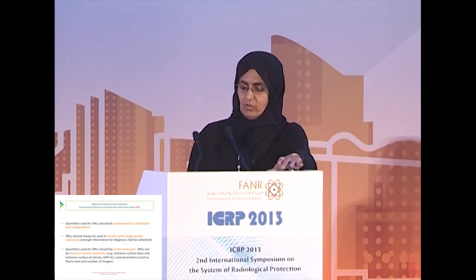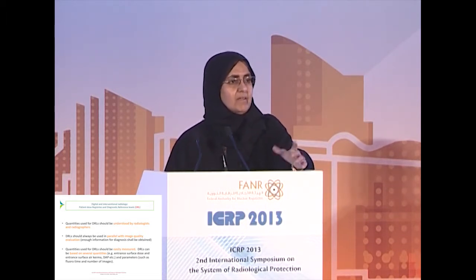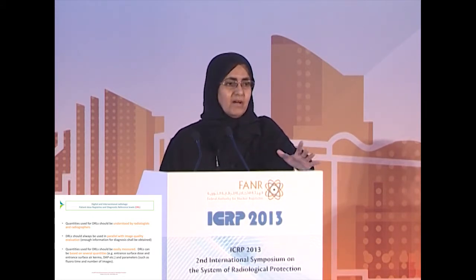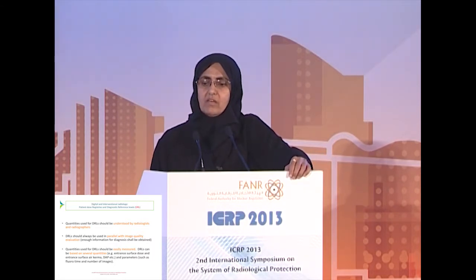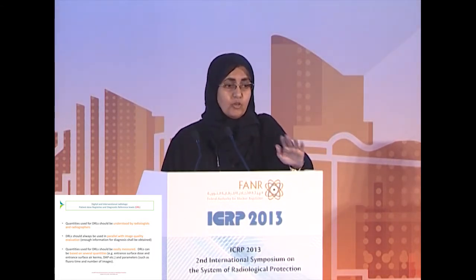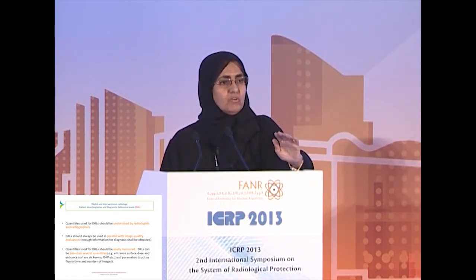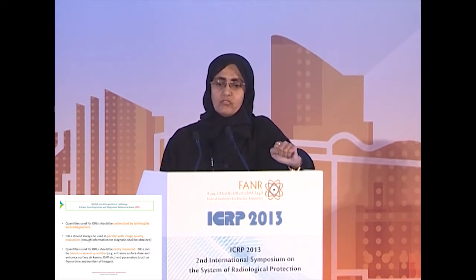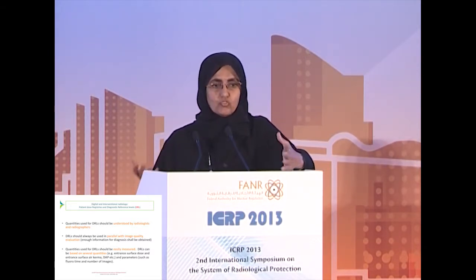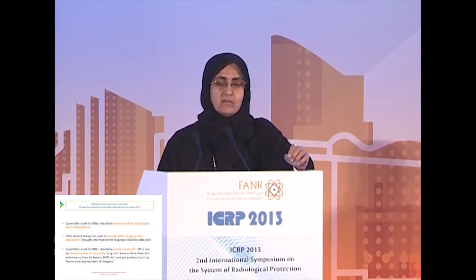Here are some quick descriptions on the DRL, because there is a lot of misunderstanding of the DRL as dose limits. Actually, DRL is not a dose limit. DRLs are quantities used to optimize the procedures that we have. So it's an optimization tool. The quantity used for DRL is very important to be simple, to be understood by the radiology team, radiologists and radiographers.